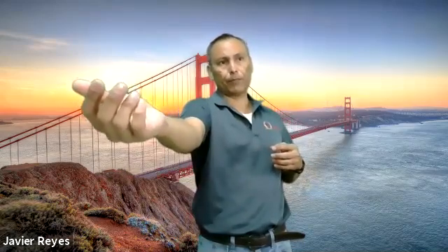They don't always have to state it verbally, but if they imply it with their actions, like putting out their arm, that's implied consent, okay? They may not say anything, but like, there's my arm. That's implied consent. That would be good enough. But you must never collect a blood specimen without the permission or against their will.